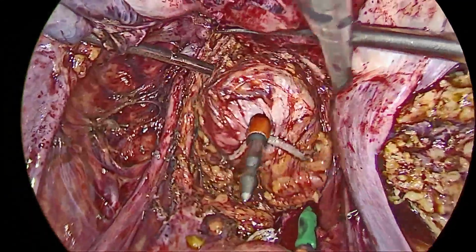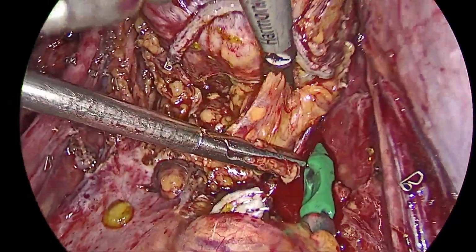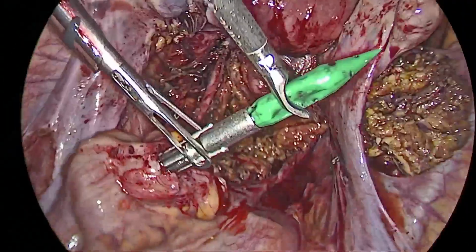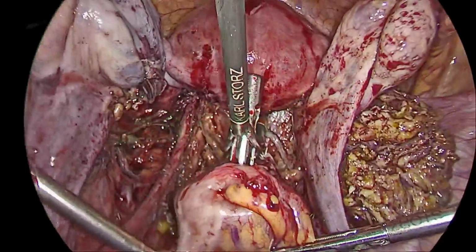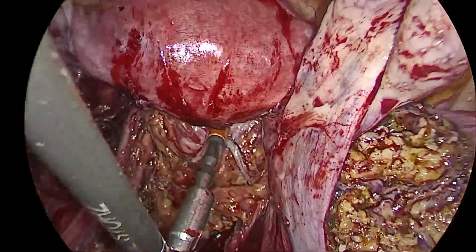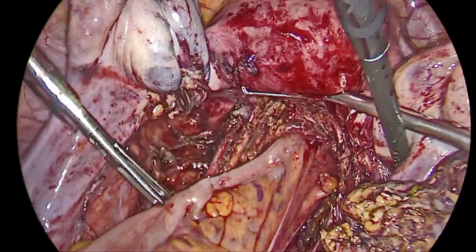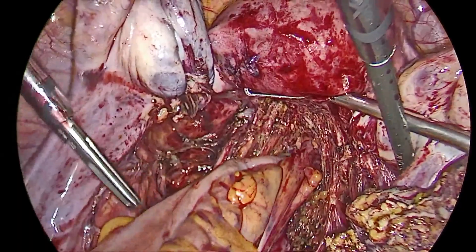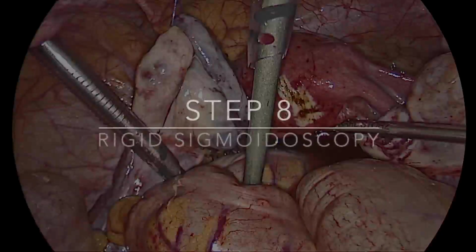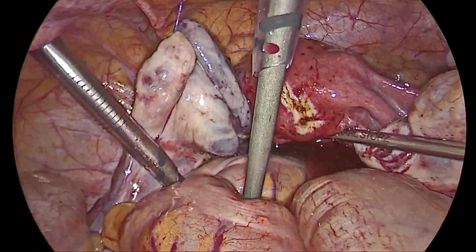The circular stapler is inserted rectally and secured through the rectal stump. Any excess mesentery is trimmed off. The anvil tip is removed. The two ends of the circular stapler are secured, and the anastomosis is completed. Care must be taken to avoid any twists in the proximal bowel, as well as any tension on the anastomosis. The procedure ends with a rigid sigmoidoscopy to ensure a negative air leak test.